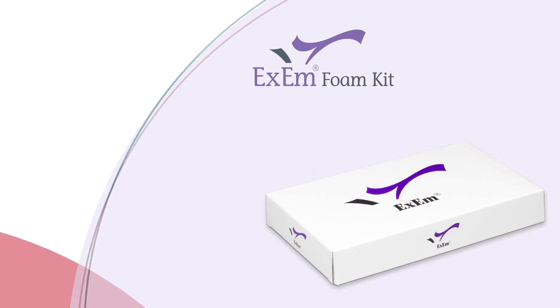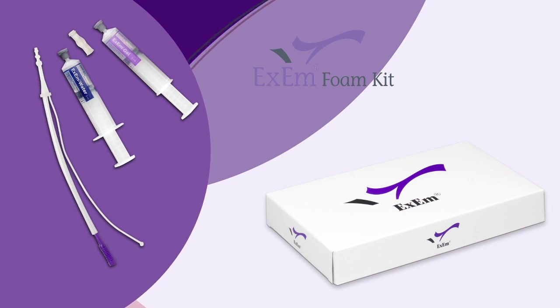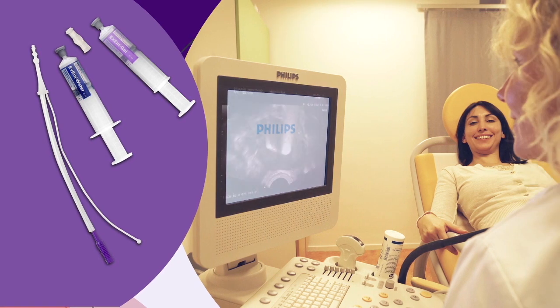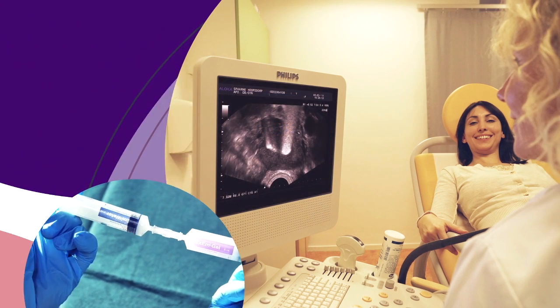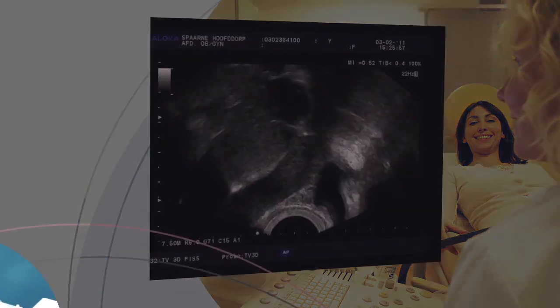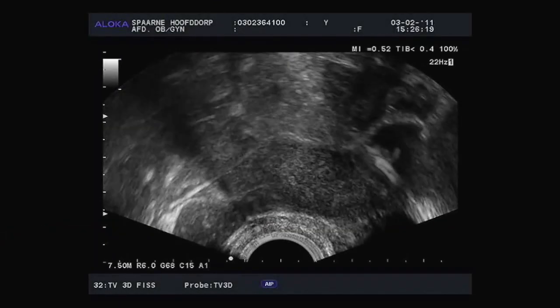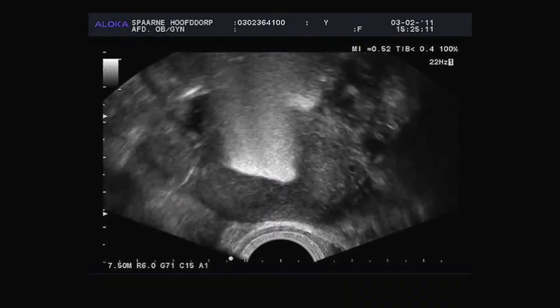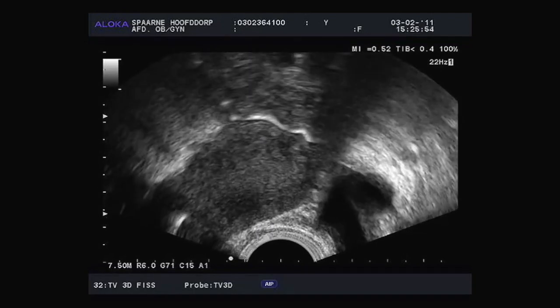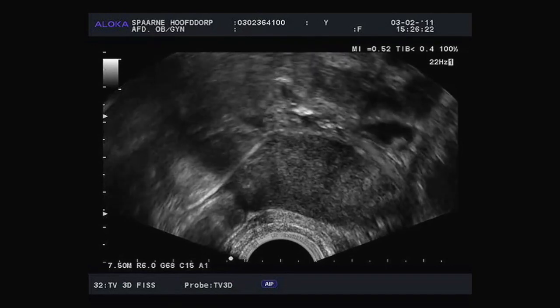ExEm Foam Kit is simply an improvement on the old HyCoSy technique. The difference lies in the composition of the gel. It represents a great improvement on the no longer available Echovist and has no adverse effects, which was sometimes the case with Echovist. ExEm is a safe gel that, when mixed with purified water, creates a tubal foam with millions of tiny air bubbles. As air is a poor conductor for sound, the ExEm tubal foam provides a very accurate ultrasound image. Millions of tiny air bubbles create a mass of small white dots which make the image very bright and white, providing a clear view of where the foam is.